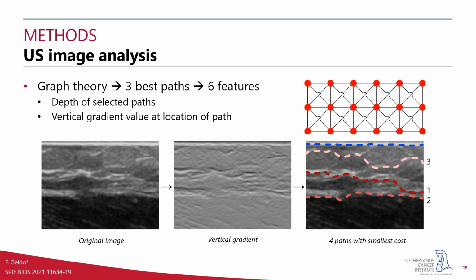The ultrasound images were analyzed based on graph theory, in which an image is represented as a graph. This is visualized in the image in the top right corner. The nodes represent the individual pixels, and the edges represent the connections between two neighboring pixels.